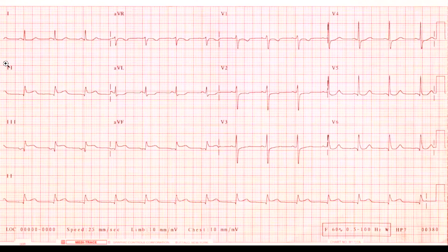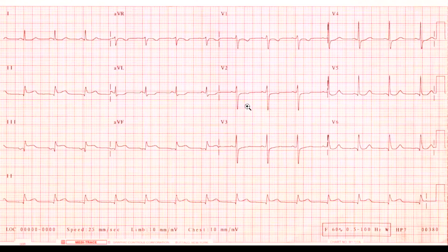Lead two is facing towards the lower portion of the heart, lead three also towards the lower portion of the heart, and AVF — we can see it's in these three contiguous leads. We don't see it in other areas looking more towards the left lateral portion of the heart, or even on the right. It's limited to one particular area of the ECG. So this ST segment elevation is very suggestive of an inferior myocardial infarction.